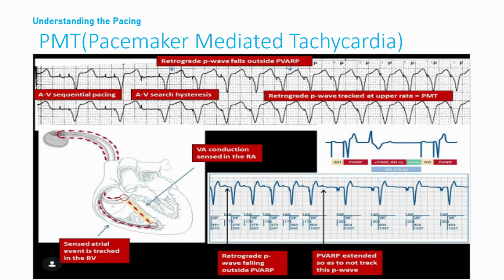So you see the pace. This is also one of the problems with pacemaker patients with dual chamber pacemakers. So here it abnormally maintains a re-entry tachycardia. Whenever a patient has got retrograde conduction, V to A, the AV node allows the conduction to go towards the A, then the impulses can go to the atria and then contract.